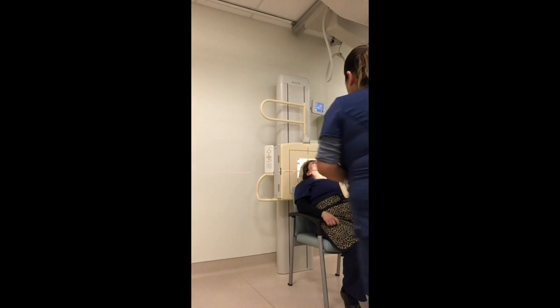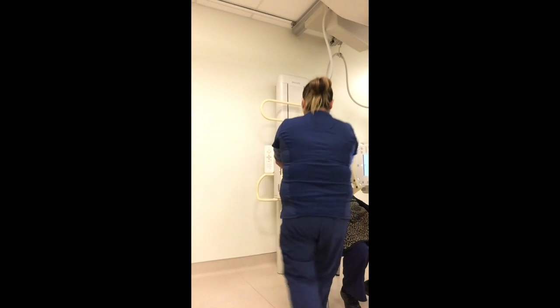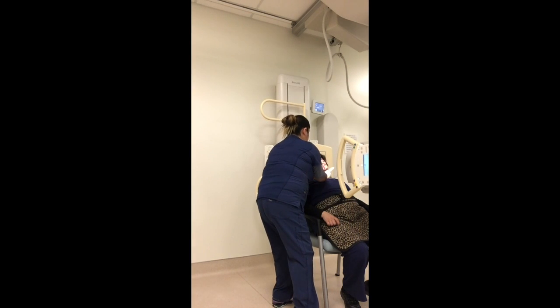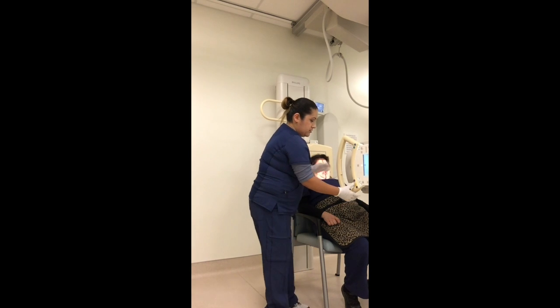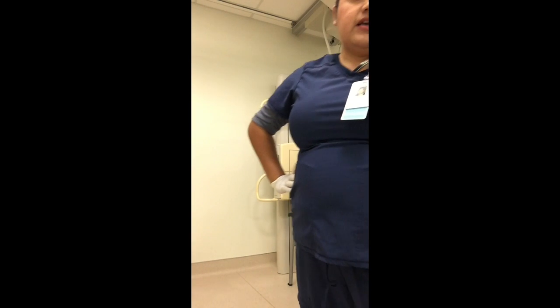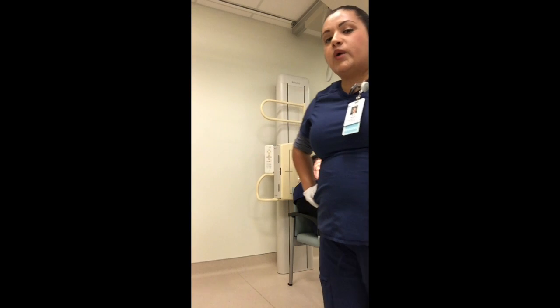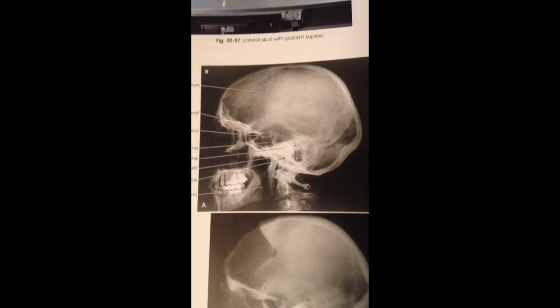Okay, Ms. Rodriguez, go ahead and hold your breath. Beep. Now I exposed. Okay, go ahead and lift your head back up, close your eyes. And the technique I would use is 85 kV to about 28 mAs.